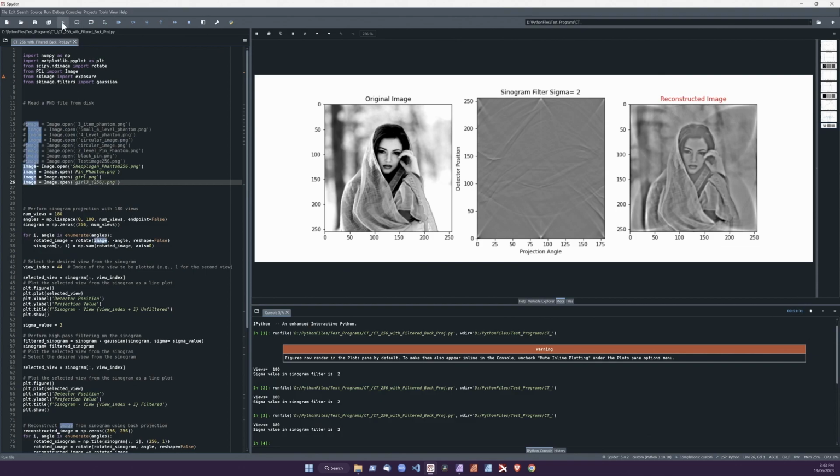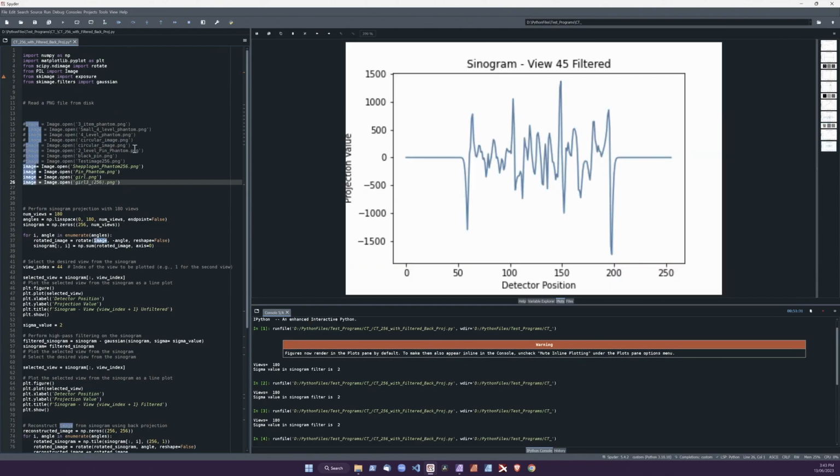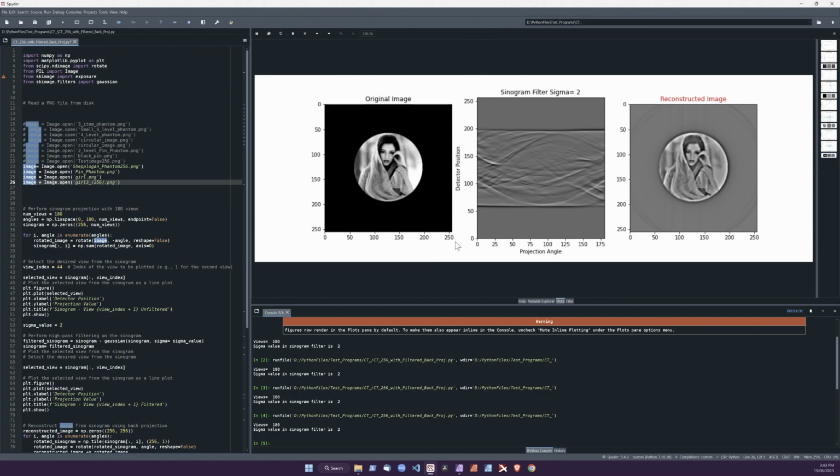The last example I'll show you is again the girl, and I've put her in a much wider black area here to try to get closer to real world, and as you can see, a lot of the artifact is gone. There we go. I was able to make ChatGPT write some software that I certainly would not be able to at my level of expertise in Python.